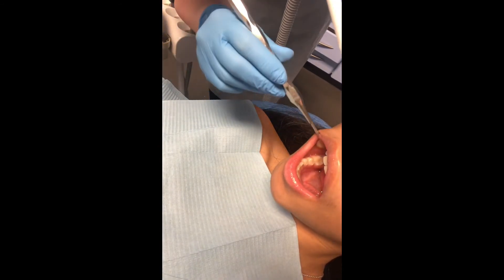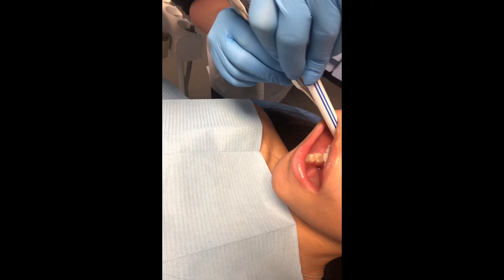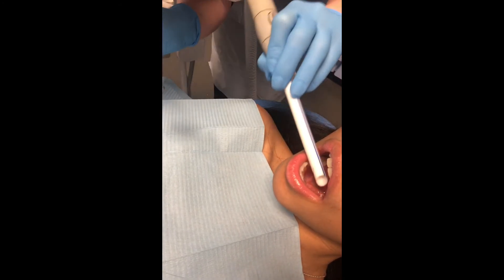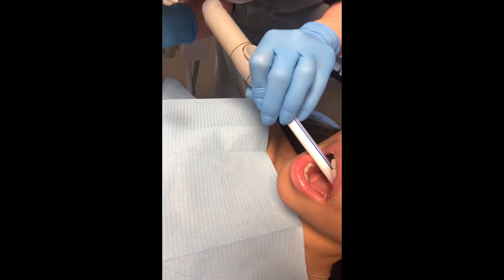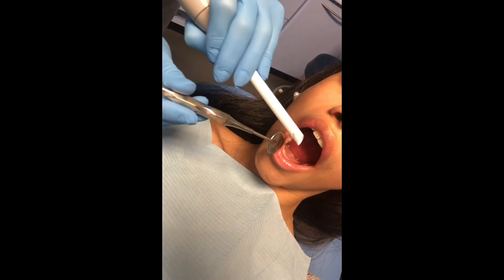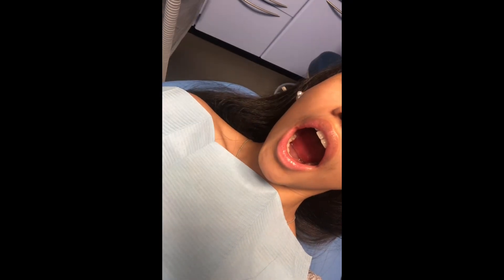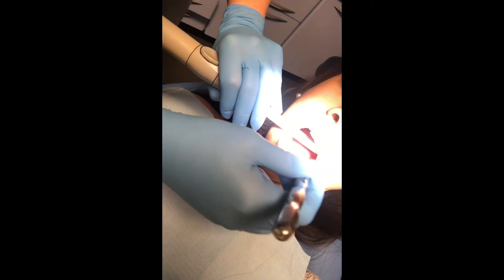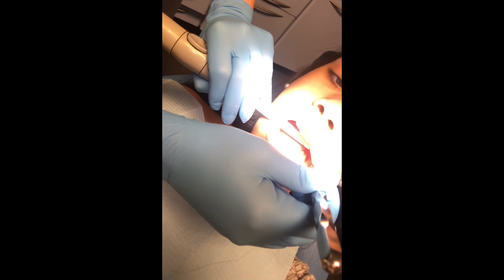For the uppers, you can use the mirror to aspirate. You should be following the dentist around and underneath as well. If we needed to aspirate for this tooth, you just go underneath there. The dentist will be retracting that side and using his mirror.